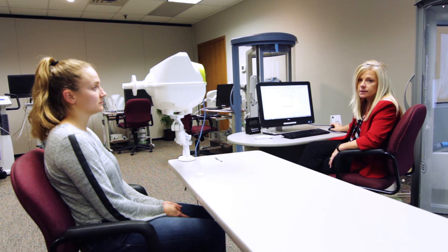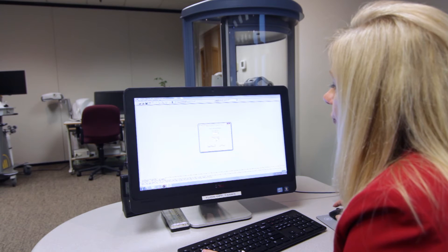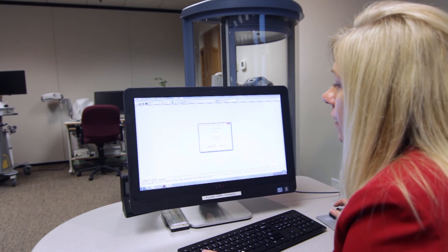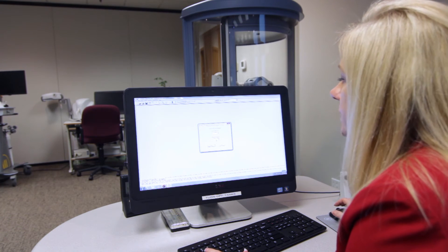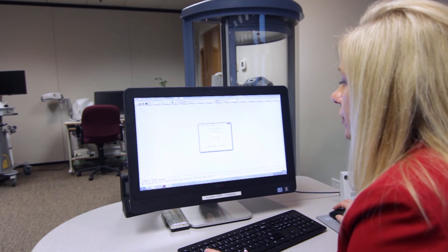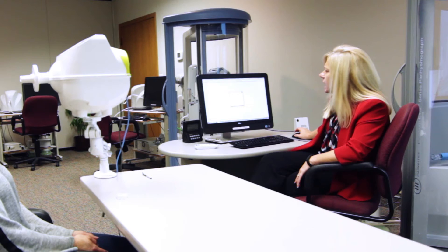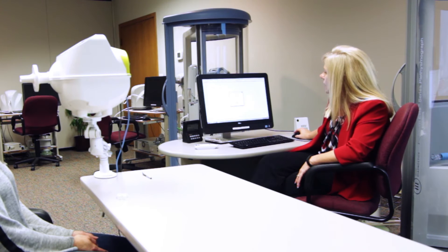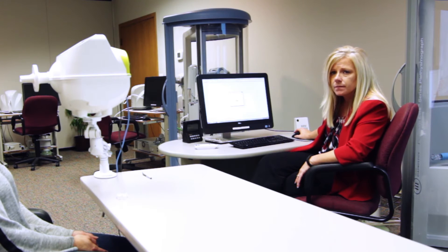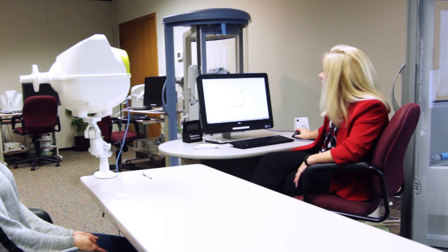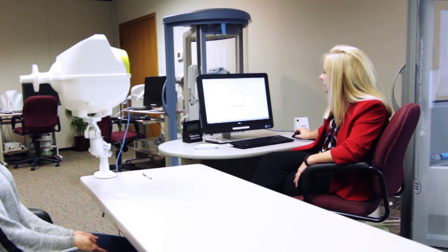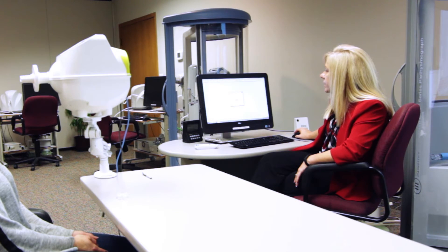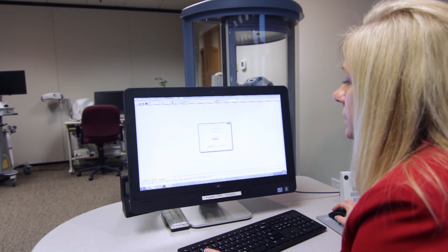Number one, our default is three minutes. The next is the frequency or the stimulation. For a normal adult, you would select 5, 11, and 19 Hertz. If my patient appeared to be obstructed, then I would select 5 Hertz. If my patient was a pediatric, then I would select 8. I'm going to go ahead and leave it at 5, 11, and 19, and I'm going to hit Submit.